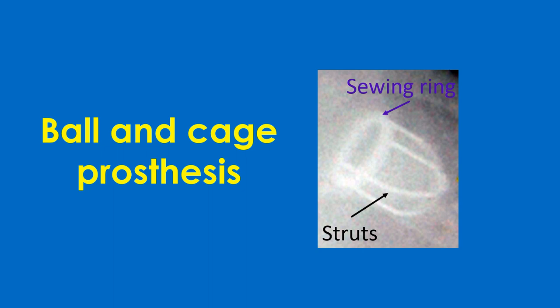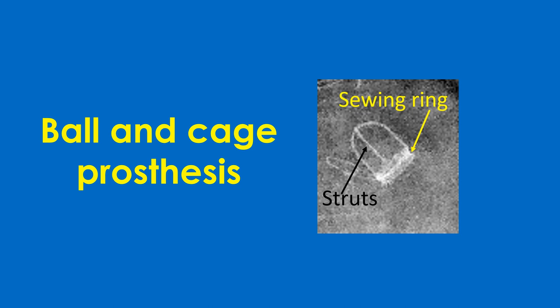This image shows a Starr-Edwards prosthetic mitral valve. The valve ring and 4 struts are visible, but the elastic poppet, being non-radiopaque, is not visible. The cage is directed downwards and to the left into the left ventricle for a mitral prosthetic valve. For the aortic Starr-Edwards valve, there are only 3 struts, and the cage is directed upwards and to the right into the aorta.